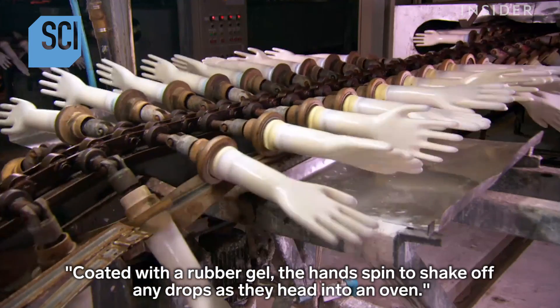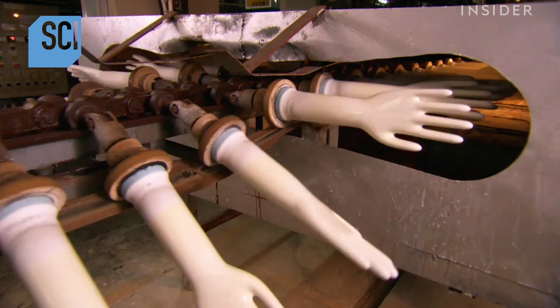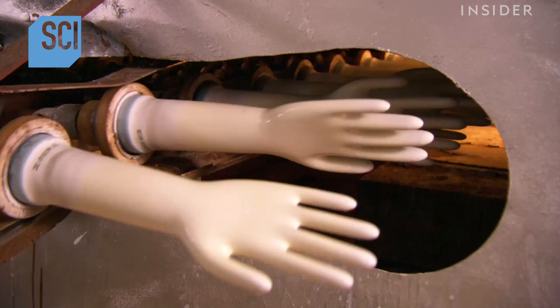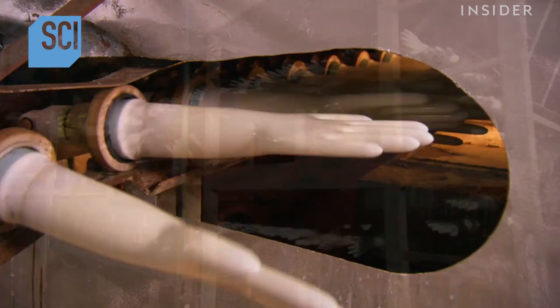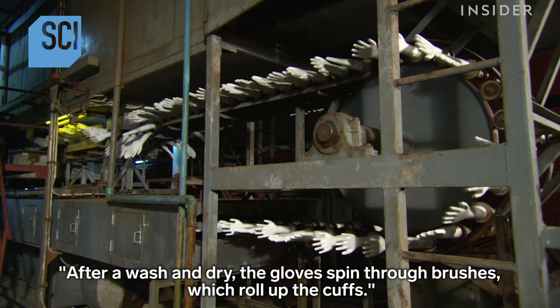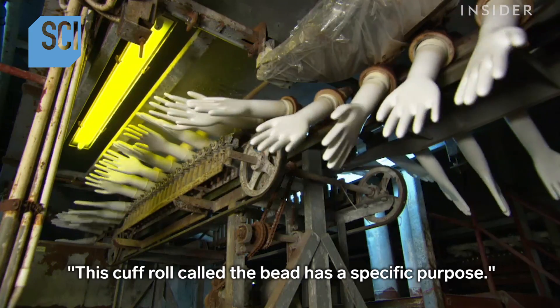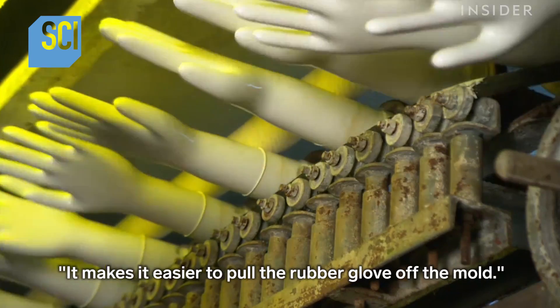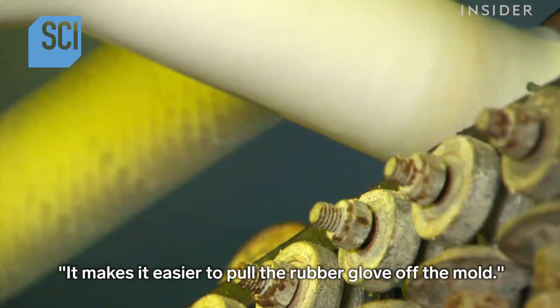The molds head into an oven where, under intense heat, the rubber dries to the hand form. After a wash and dry, the gloves spin through brushes which roll up the cuffs. This comfortable roll, called the bead, has a specific purpose: it makes it easier to pull the rubber glove off the mold.